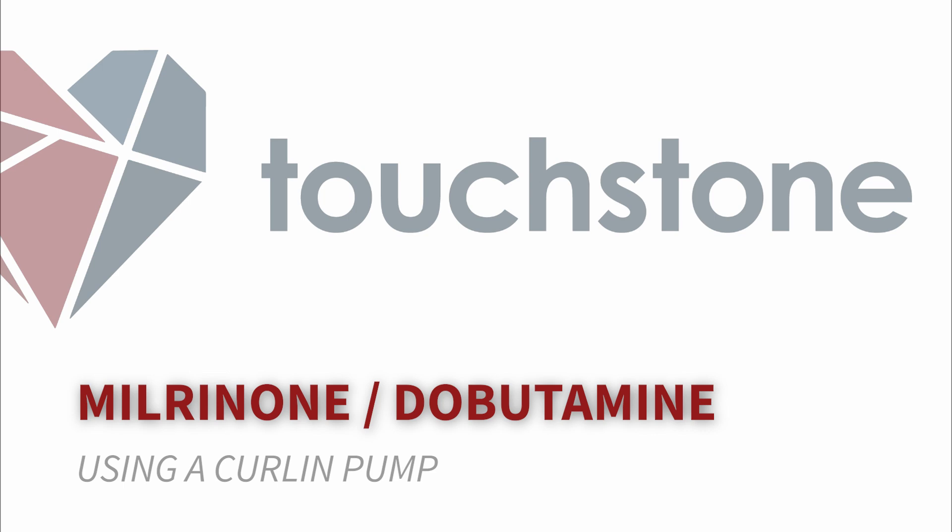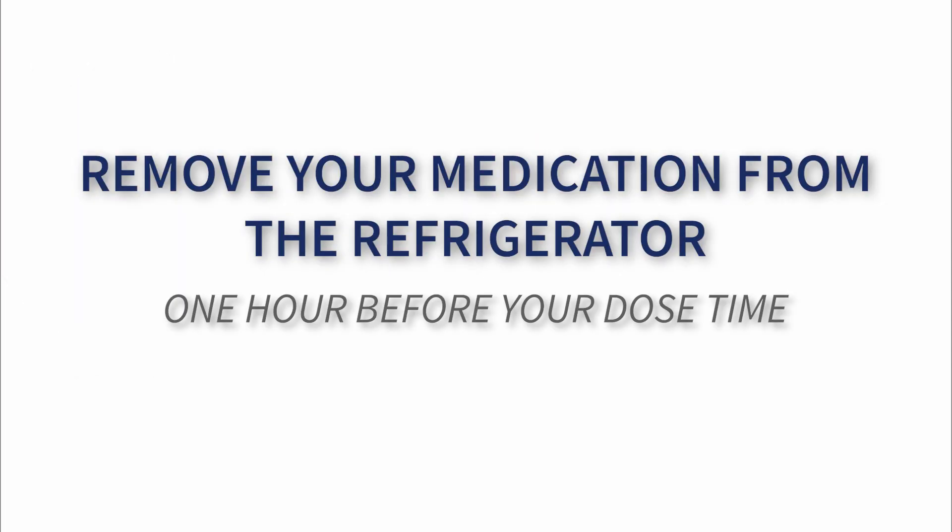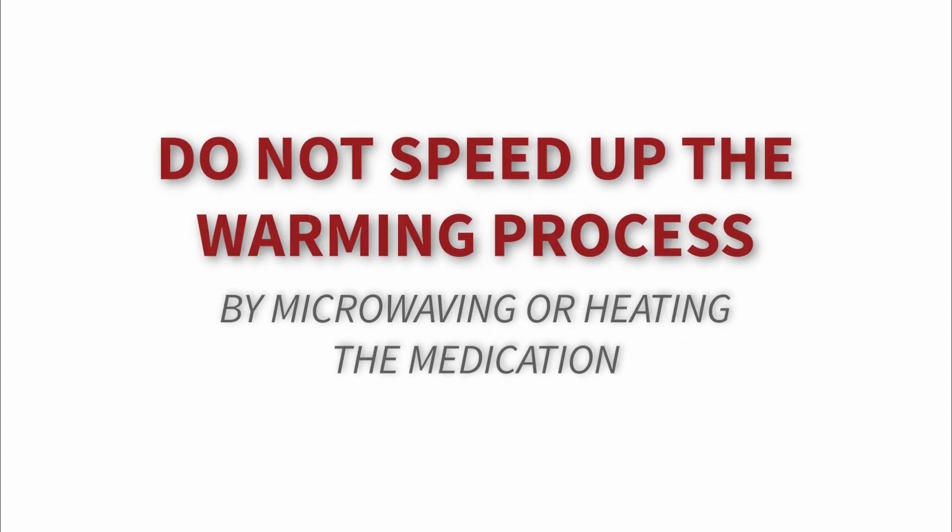In this video, Touchstone Infusion Pharmacy will be providing step-by-step instructions on how to administer your prescribed milrinone or dobutamine infusion using a Curlin pump. Be sure to remove your medication from the refrigerator about 1-2 hours before it is time to change your medication bag. It is important to never speed up the warming process by heating or microwaving your medication.